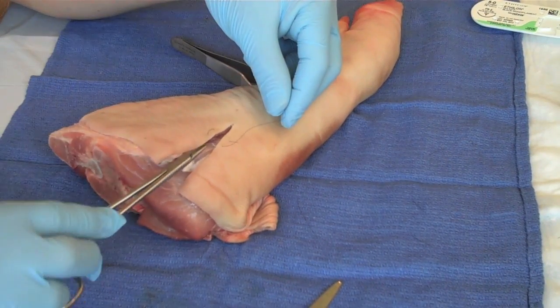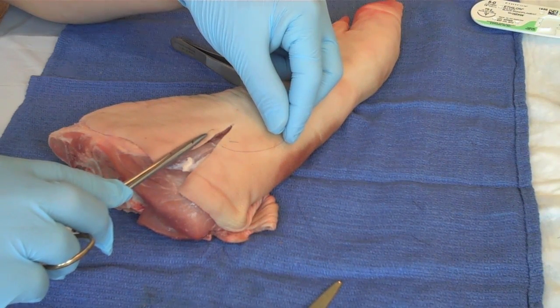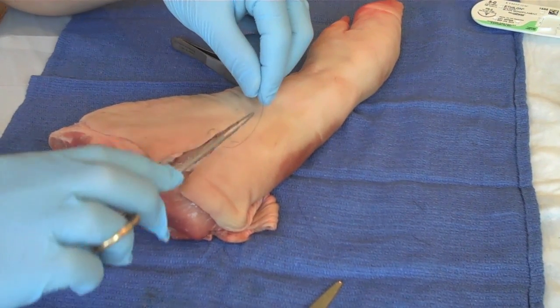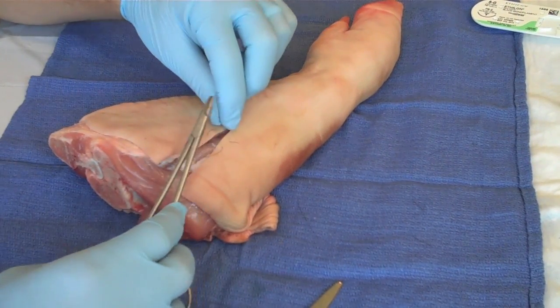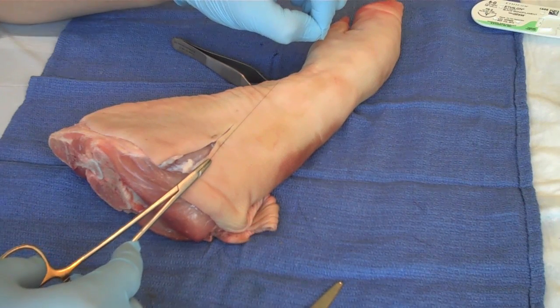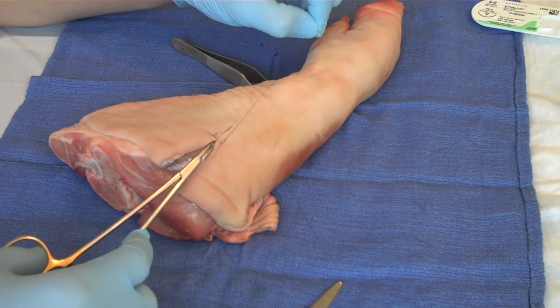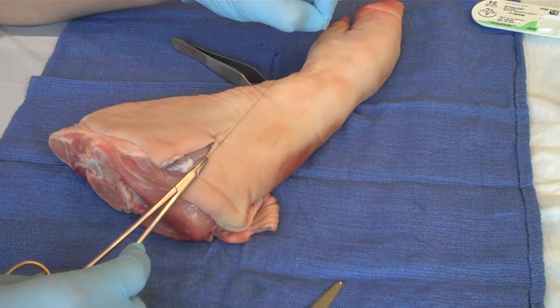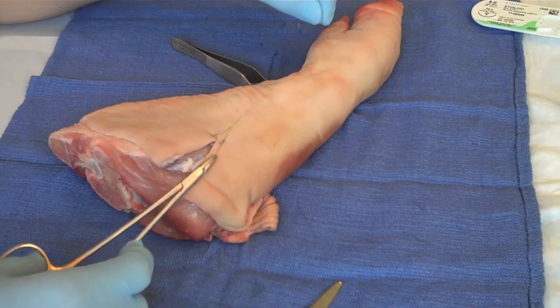So the technique is: you go in, come out, move down a centimeter, go in, come out. Then laying your needle driver in the center of your field, do two loops for the first surgeon's knot. You see how that brings it nicely together, everts the wound edges, and takes tension off the field. Come back and tie your knot.